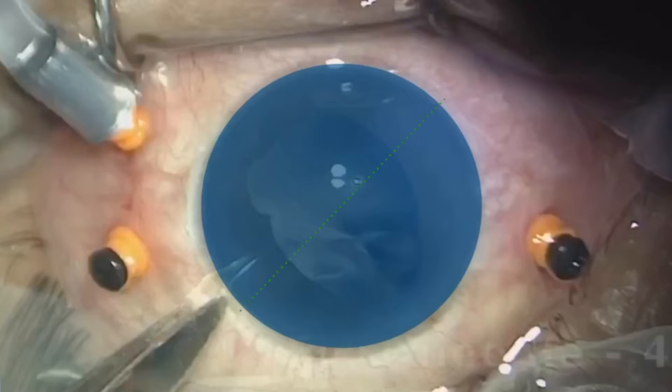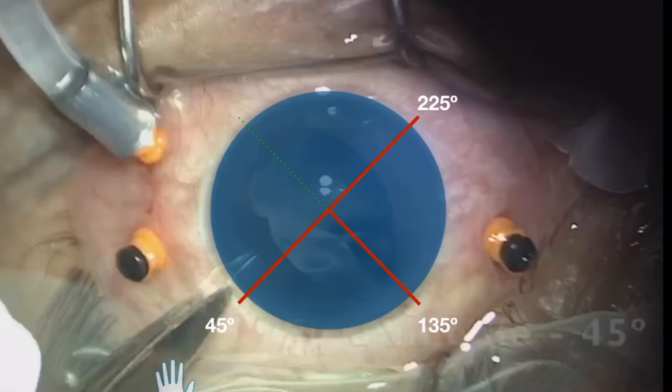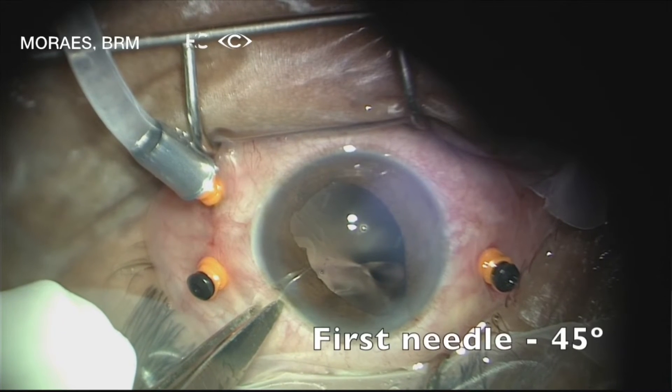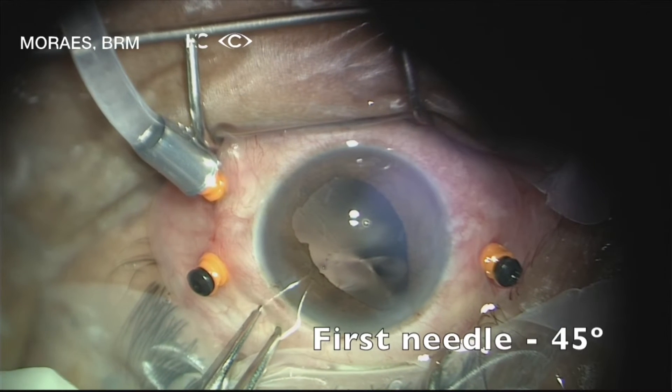The first tip is to set the position of the corneal incision and the places where the haptics will be grasped through the sclera in a virtual T position. The surgeon set a virtual T at 45 degrees and 225 degrees for the haptic positions and a corneal incision at 135 degrees. The first needle was inserted 2 mm from the limbus in the 45 degree position.